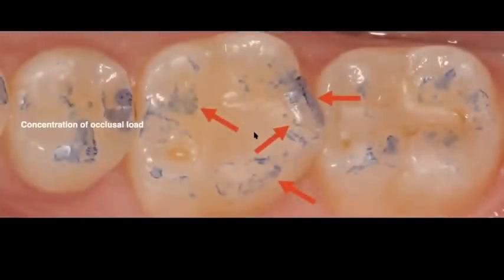So what you're seeing here, you can see that they had an initial contact in this area. You can see that the composite is still contacting some here, but because there was a contact here, this composite fractured here. Same as you are seeing here on the lingual side. You can see that there's still some contact here on the tooth, some contact on the composite right in the interface. You can see the fracture right here in this area. So this is something that I commonly see.